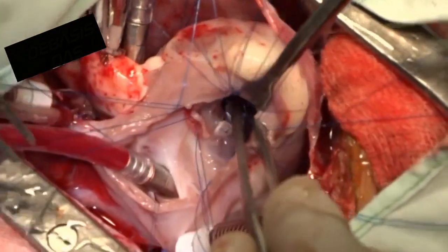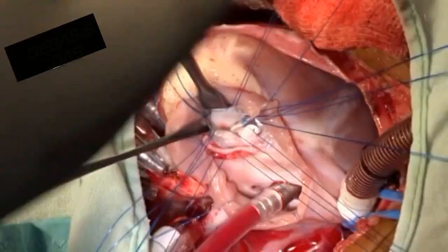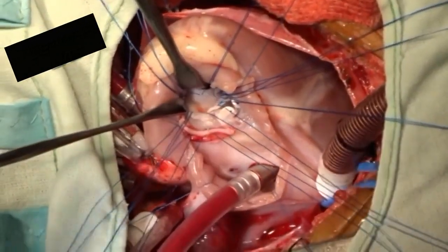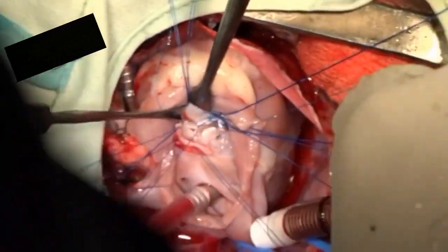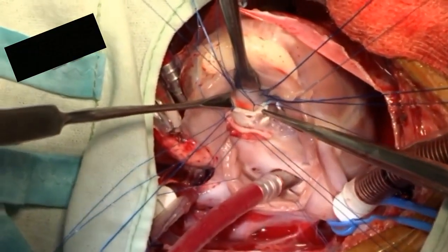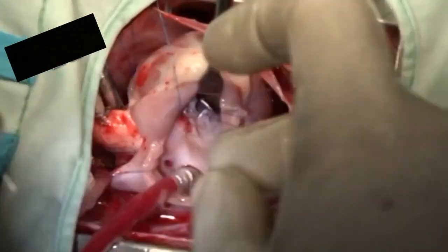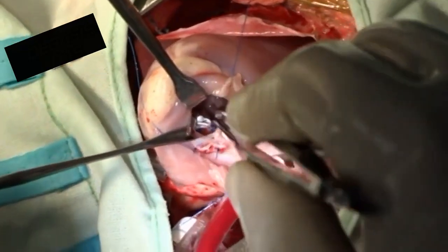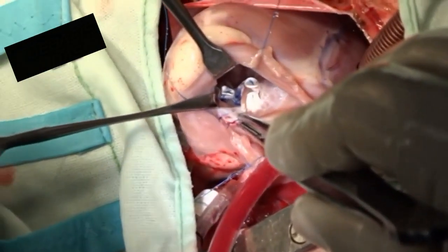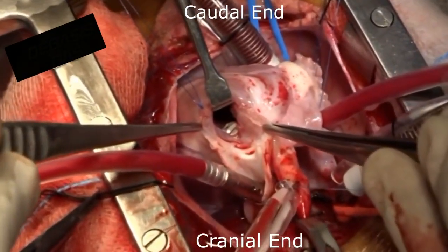and sutures are sequentially tied without using excessive force to close the VSD securely. Again, at this stage, retraction should be minimum. All the sutures are sequentially tied. The VSD closure is now complete. A visual inspection of the entire patch is done, and the focus is now shifted onto reconstruction of the RVOT.